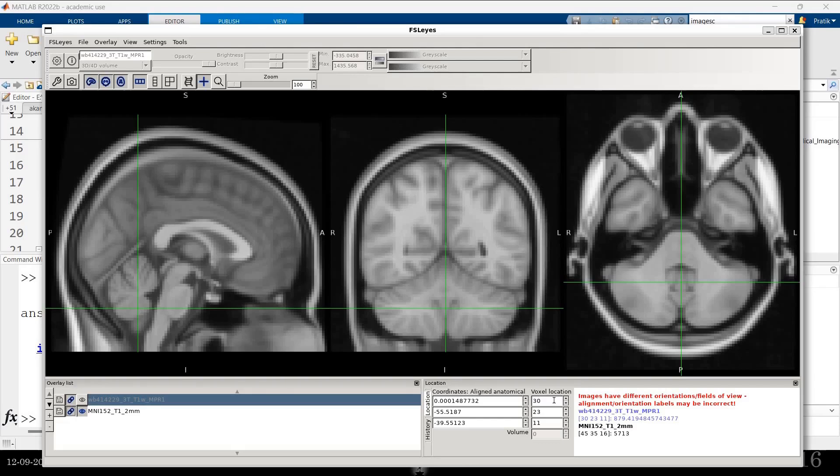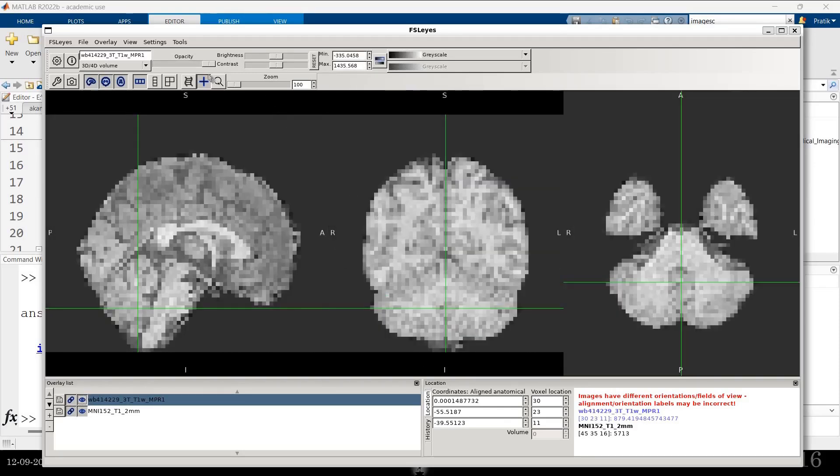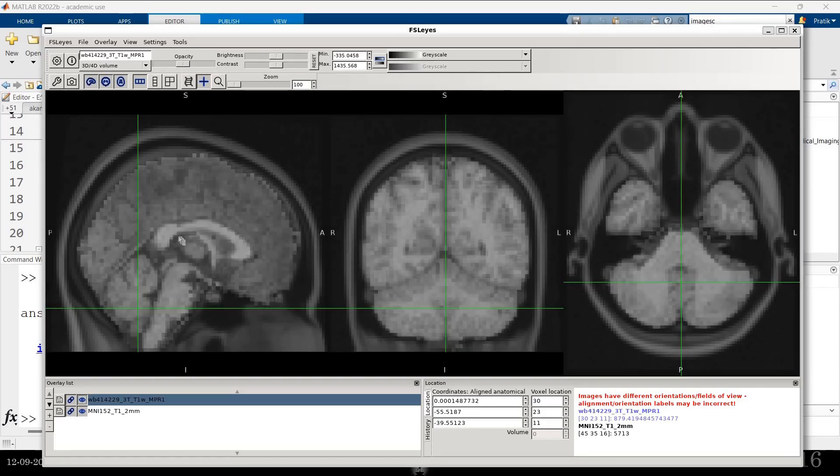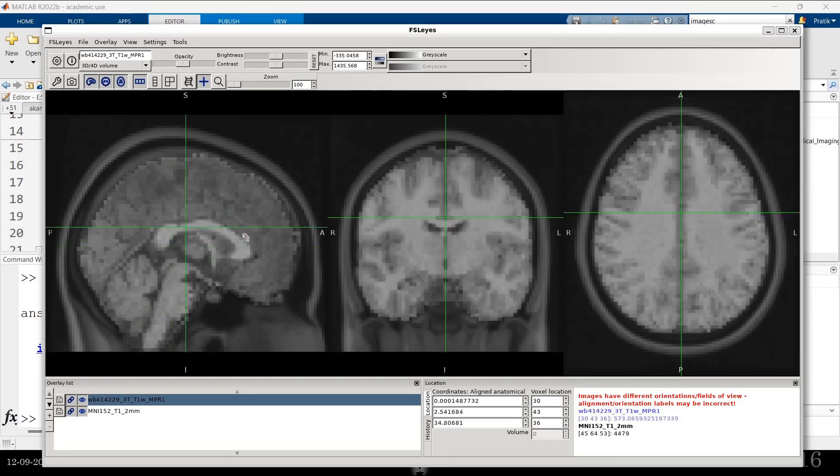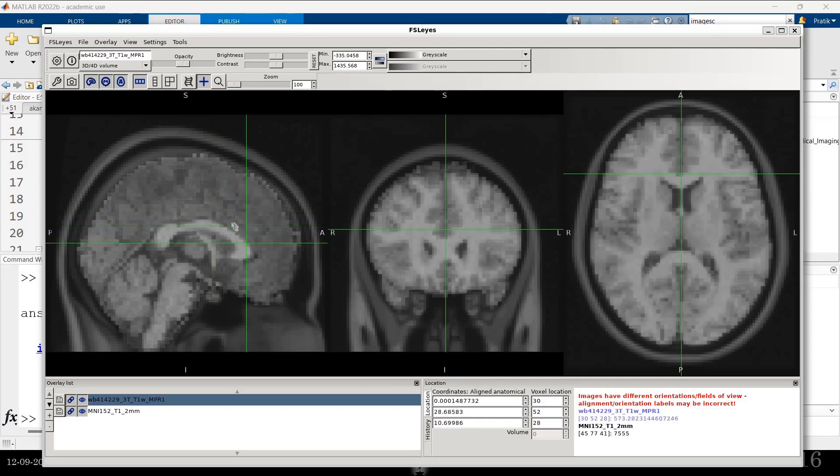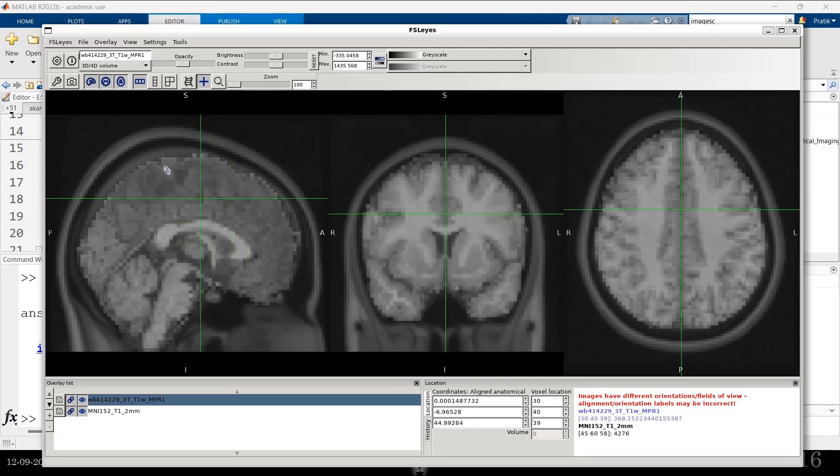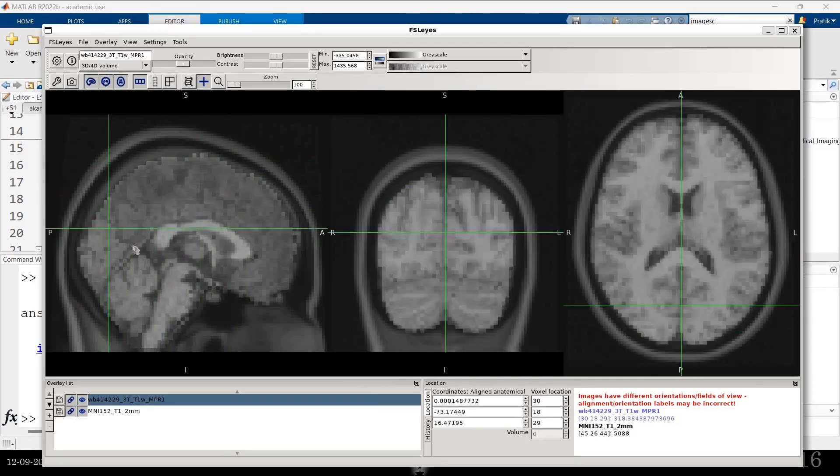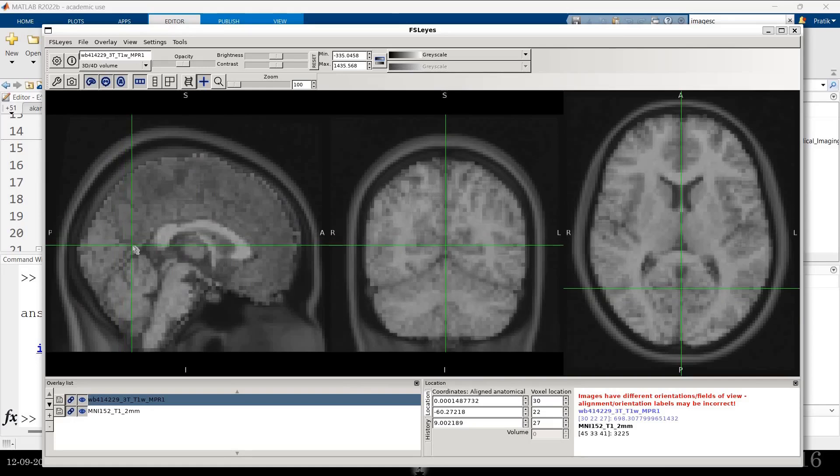Notice that the voxel coordinates for, let me reduce the opacity. You can see both of these are perfectly aligned. The brains are perfectly aligned. That's because I have done that.